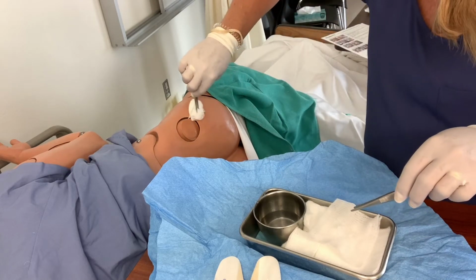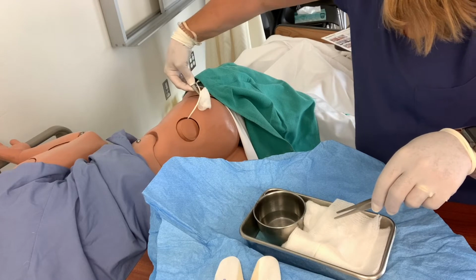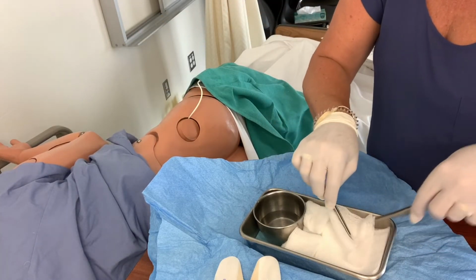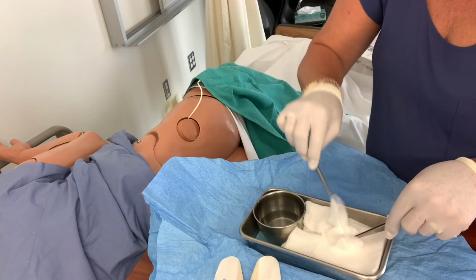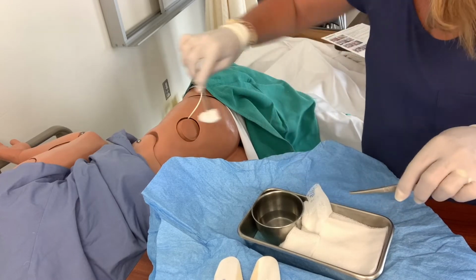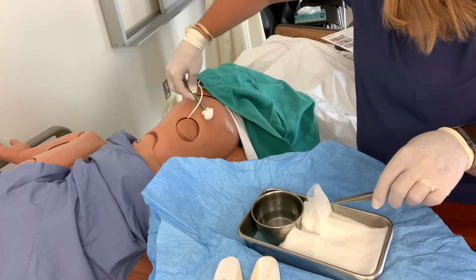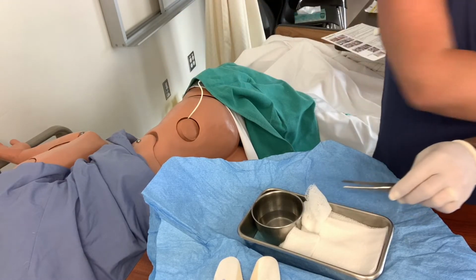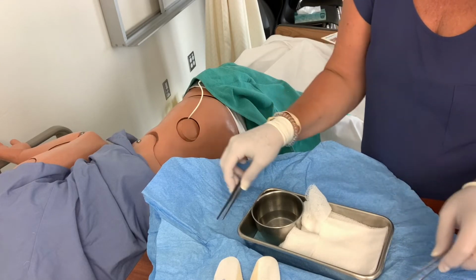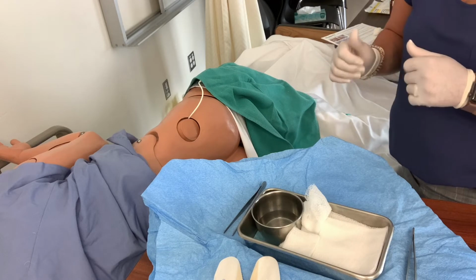Okay, so I'm going to start at this insertion site, and I'm going to work my way around and just get it out. I'll do one more dry. So basically same sterile field, same insertion site, just work your way out. I'm going to drop that and wash it and dry it accordingly. I'm going to leave these on the inside of my sterile field because I'm going to save them. I don't technically need them, but I'm going to keep them there.